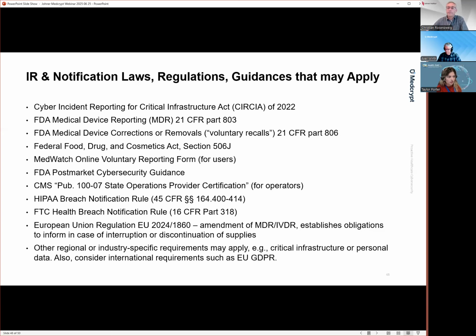And then, are there any significant differences you would consider between the pre-market cybersecurity risk assessment and the post-market cybersecurity assessment? Can the pre-market assessment continue to be utilized and updated once the device is released into the market? So from a basic process and tooling perspective, there's certainly continuity.